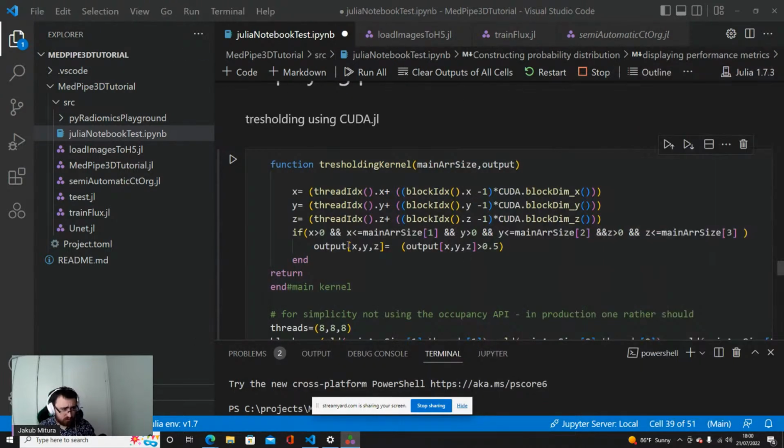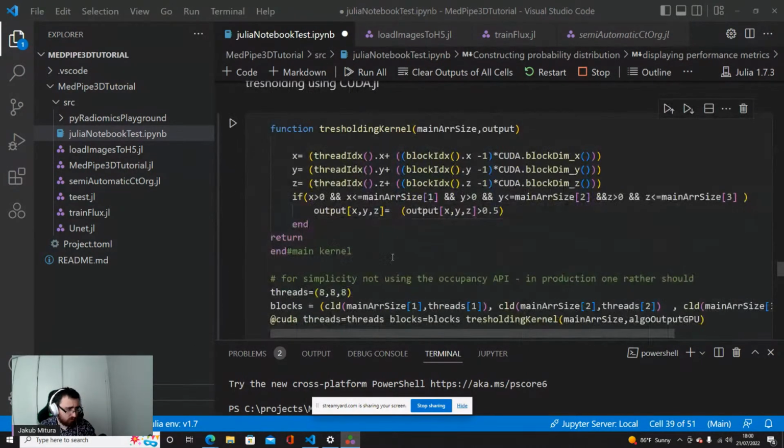This is also a very simple thing. We can do a kernel or parallel stencil, or it would be even better to use normal CUDA arrays to map it. But we need to threshold it. When the value is above some threshold, in this case I arbitrarily chose 0.5, we decide that this is truly liver.